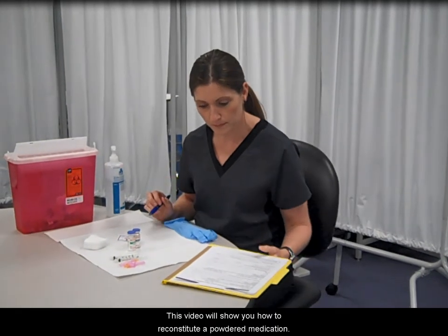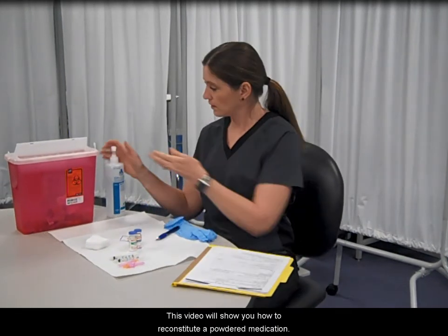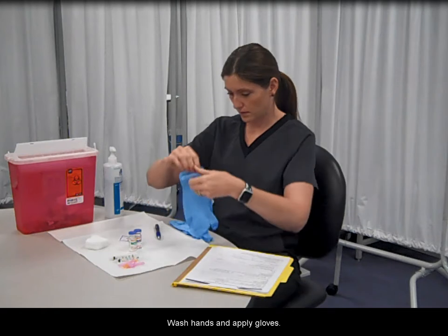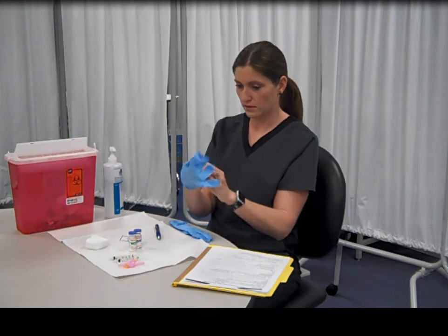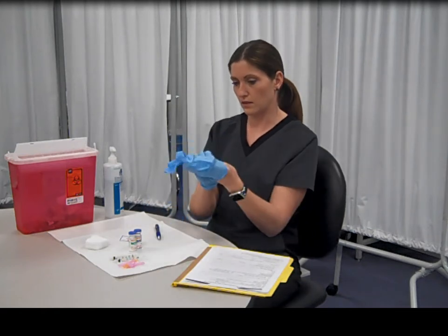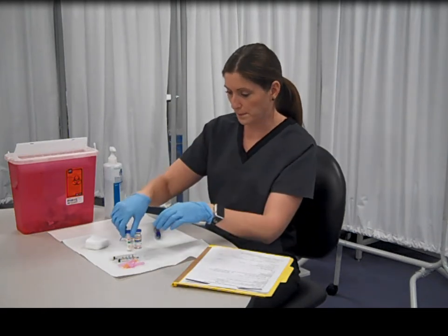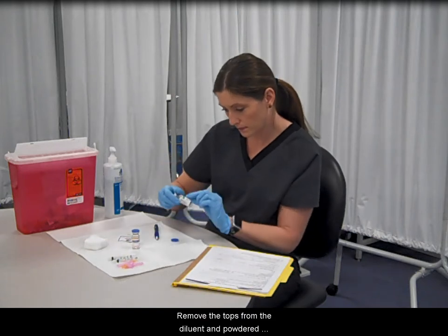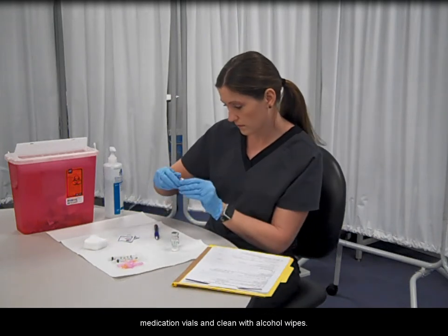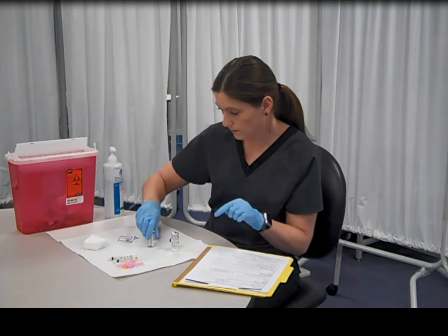This video will show you how to reconstitute a powdered medication. Wash hands and apply gloves. Remove the tops from the diluent and powdered medication vials and clean with alcohol wipes.